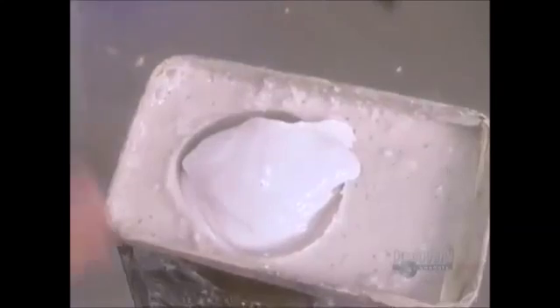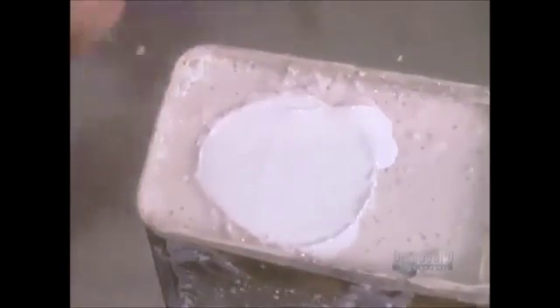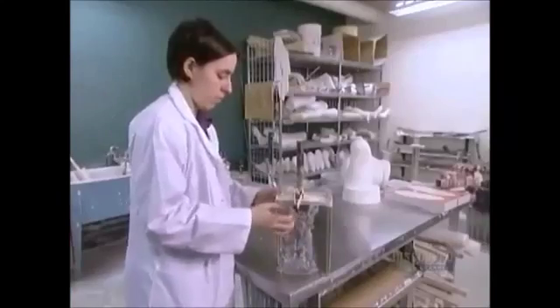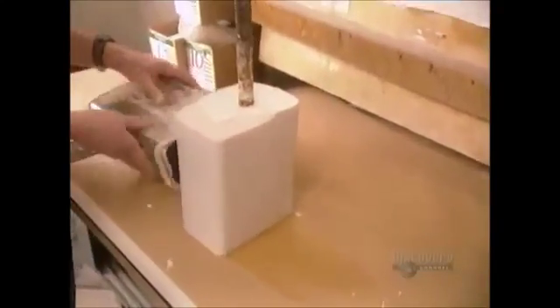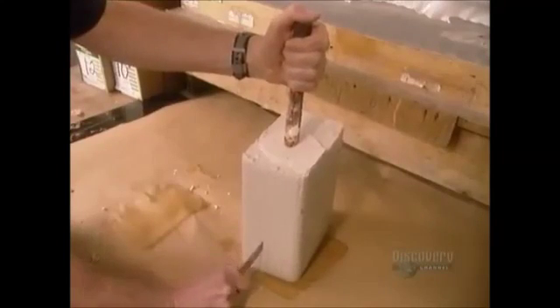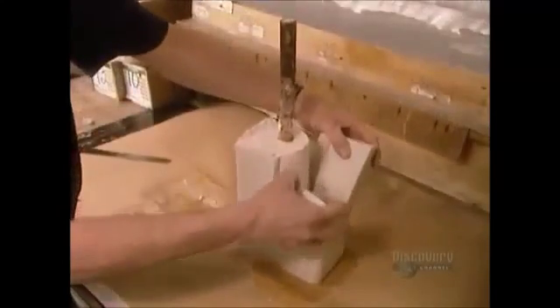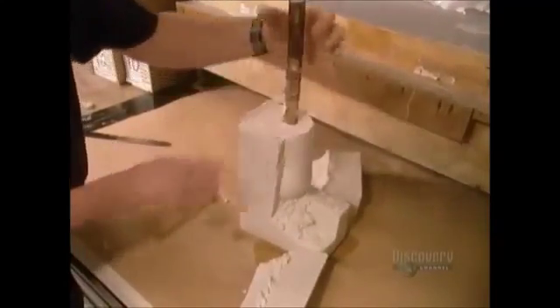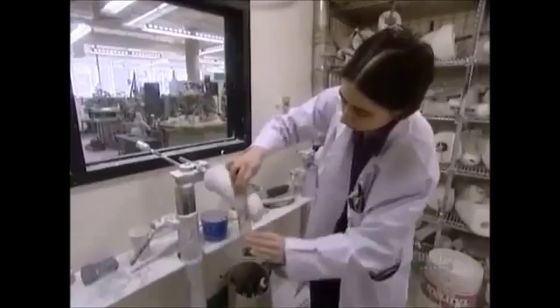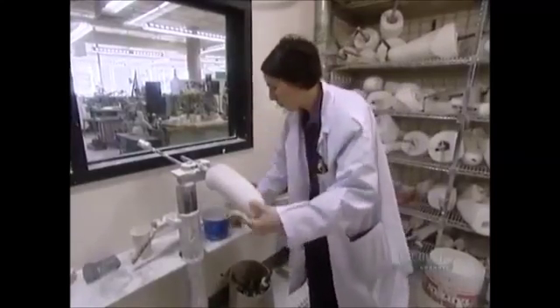They pour in plaster of Paris, then insert a metal rod. The rod is what will later allow them to mount the dried plaster to work on it further. The plaster takes about an hour and a half to harden. They cut off the algin, then using sandpaper and files, they refine and smooth the surface. This plaster copy of the residual limb will now be used as a positive mold to cast the artificial limb.